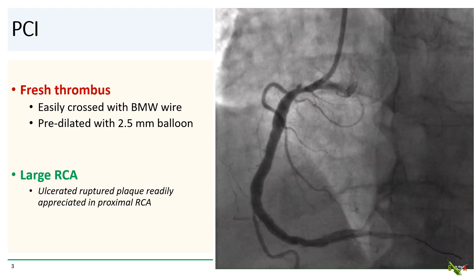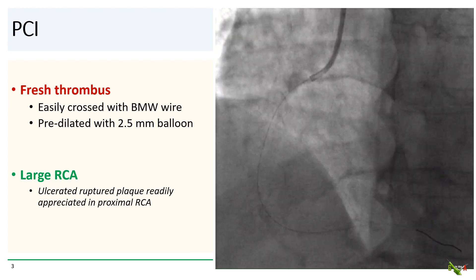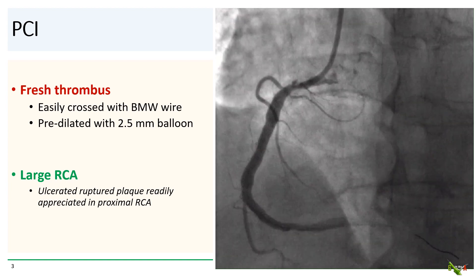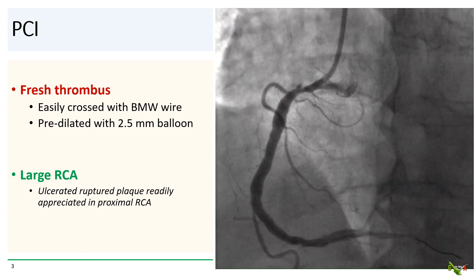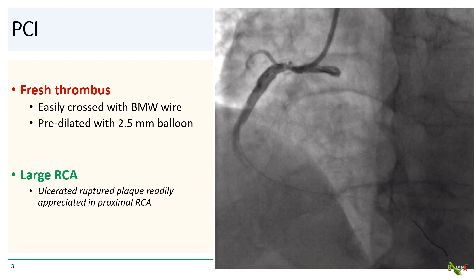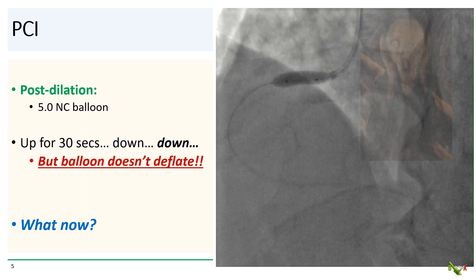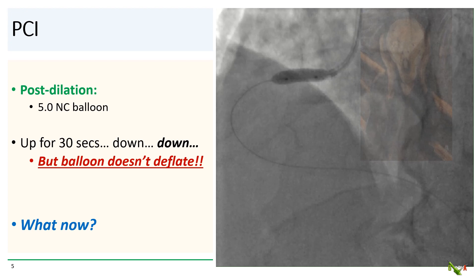The case started out innocently enough. We easily crossed the fresh thrombus with a BMW wire, and after predilation the RCA turns out to be quite large with an ulcerated ruptured plaque clearly visible. We deployed a 4.5 mm DES in the large RCA, and the 4.5 mm stent actually looked a little bit undersized. So we went ahead and post-dilated with a 5.0 mm non-compliant balloon. We went up for 30 seconds, but then the balloon wouldn't come down.